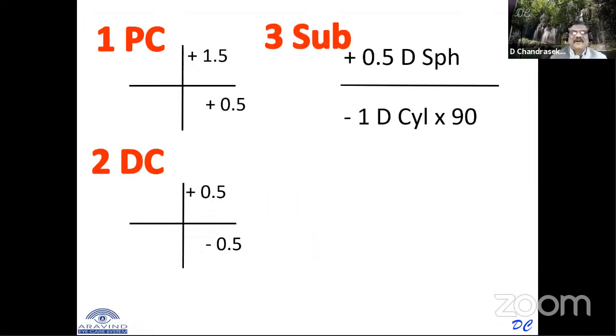If I take plus 0.5 diopter spherical, that means it is there everywhere. But how much do you want at 180 degree? You want minus 0.5, so you have to neutralize that 0.5. So you have to add both. 0.5 plus minus 1 is equal to minus 0.5. Only then it will neutralize that 0.5 and give you minus 0.5 at 180. So you give minus 1, and since you want it at 180, you give it at 90 degree. It's a minus 1 at 90 degree.